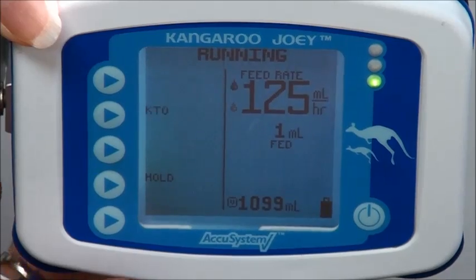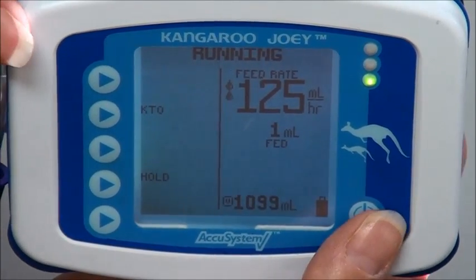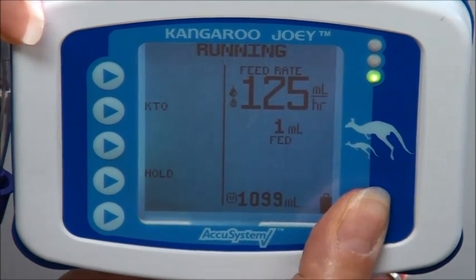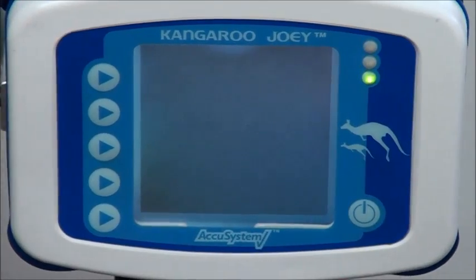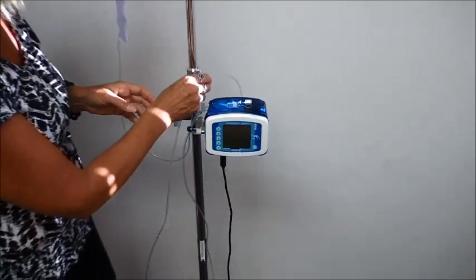Now when I'm all done using the Kangaroo pump, I can go back here to the power button and power it down. But you do need to hold the button while it powers down in order for it to turn off. That's how you would program your pump.